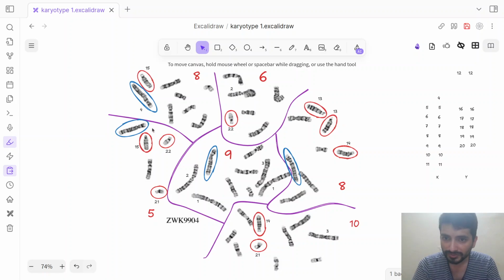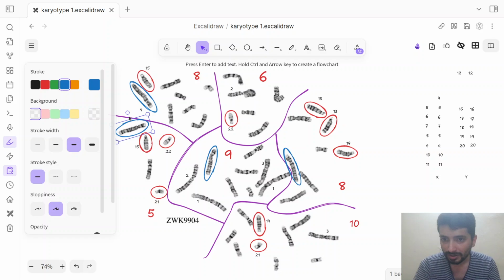If you look at chromosome 5, you can see a similarly staining dark band on the short arm, but the longer arm has several bands over here. And if you can imagine this chromosome being shrunken down a little bit and the white between these dark bands disappearing, this would actually appear like a box. So chromosome 5 is said to have a box band on its longer arm. So this is actually chromosome 5.